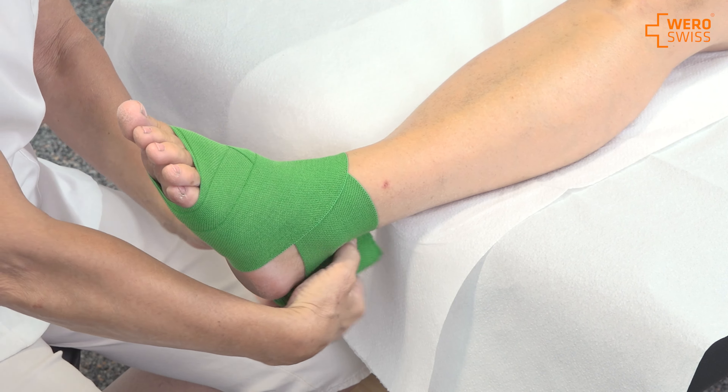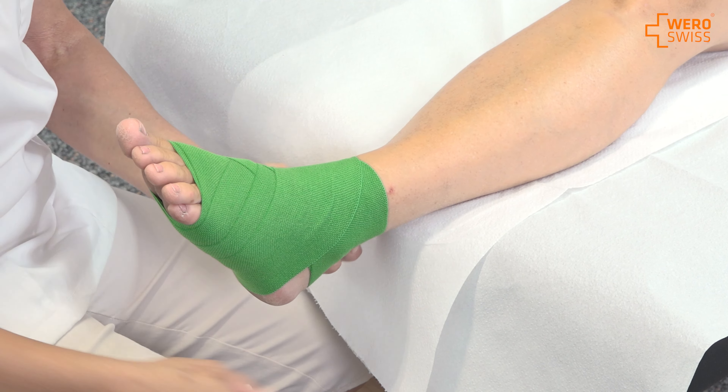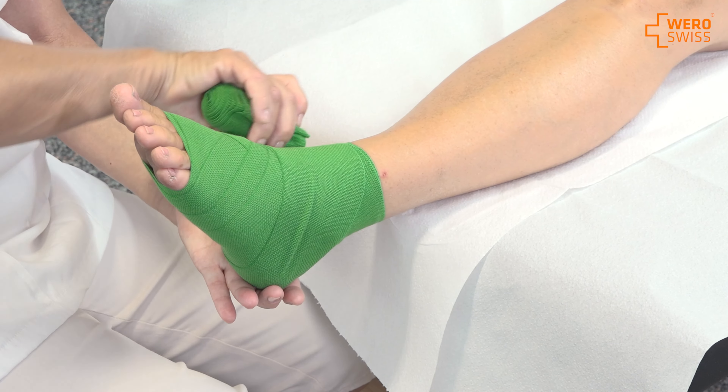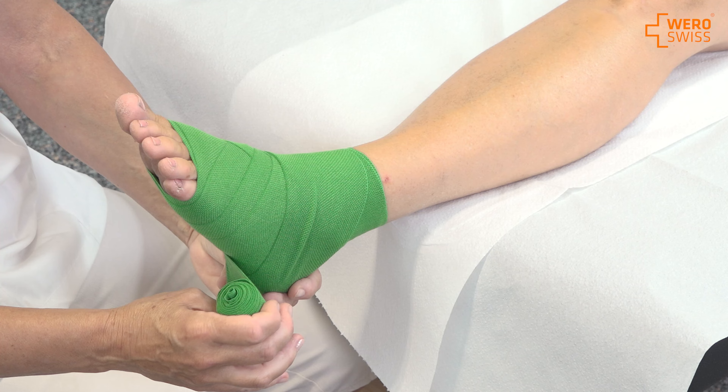Here you can see the figure-eight very nicely. It's very tight and very firm, and they need that when they have an ankle problem. Now I'm going to cover the heel — I stretch over the heel and go back and make it stay.